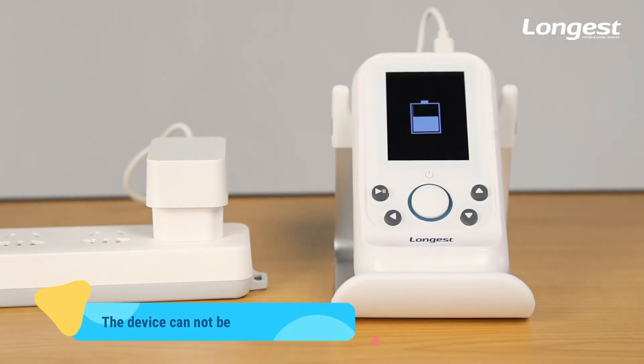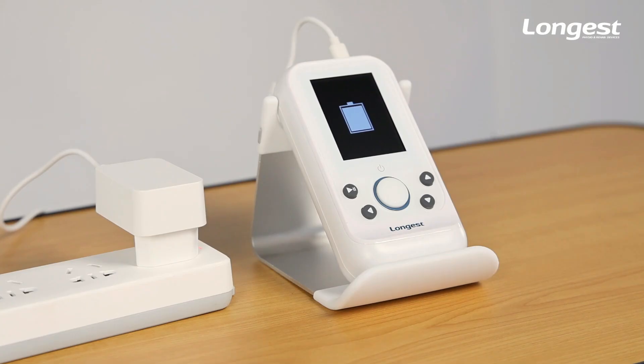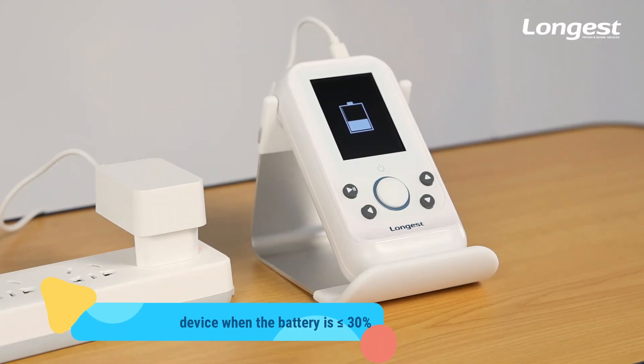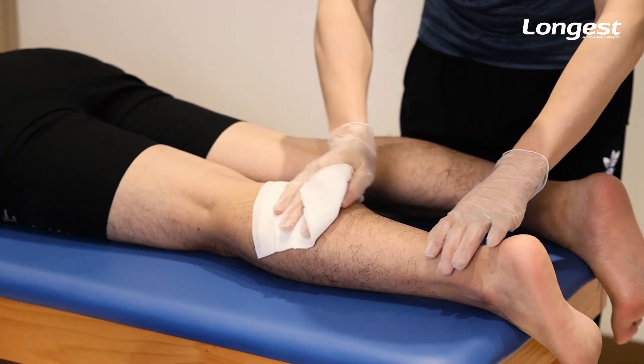Before use, please make sure the device has enough power for the treatment. It is recommended to charge the device when the power is lower than 30%.